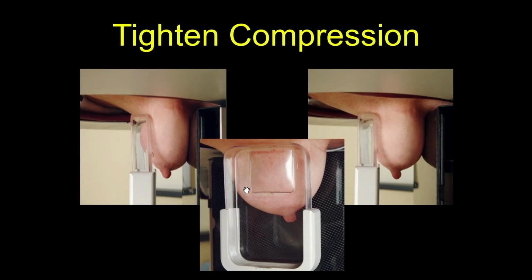The solution is to stretch a Tegaderm over that opening after the skin is cleansed. That causes much better compression of tissue. Here you no longer see the bulging, and hopefully that improves the visibility of the lesion, and you can biopsy through the Tegaderm.